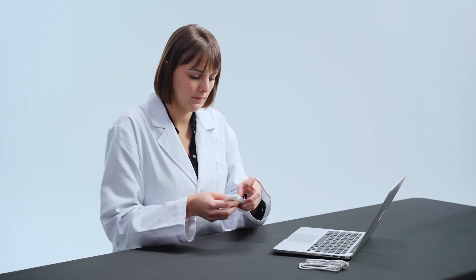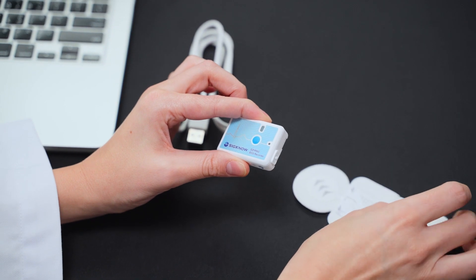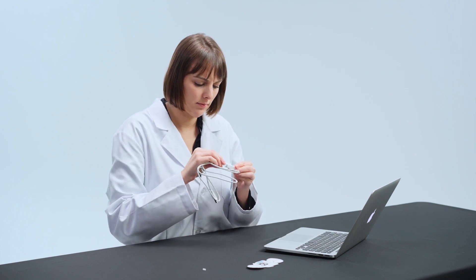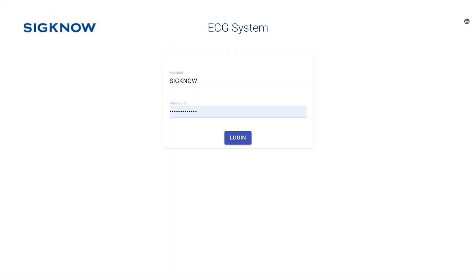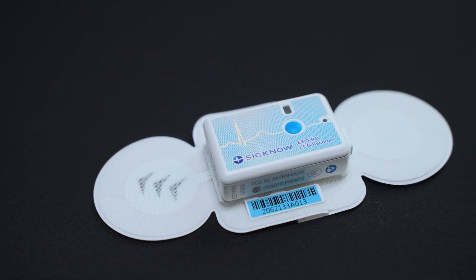Patients will return EasyPro at their next appointment. Please download the ECG data on a computer and upload the data to the report cloud system EasyConnect. The EasyPro analysis team will take it from there. EasyPro is the most advanced arrhythmia diagnostic tool for health professionals.